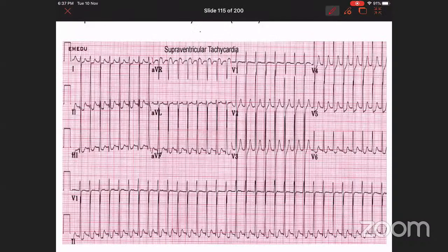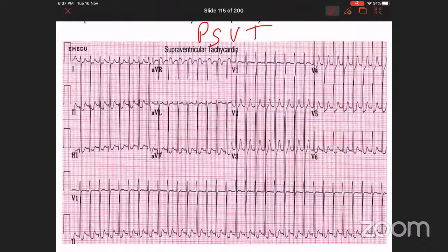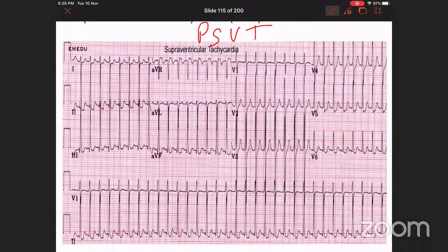The ECG of PSVT looks like this. The rate is very fast — literally about 300 thereabouts. All QRS complexes are narrow, there are no P waves to be seen, and one complex looks exactly like another. We call this monotonously regular complexes — each QRS is a photocopy of the one before and after. A fast rate, narrow complex, and absence of P waves give us the picture of PSVT.